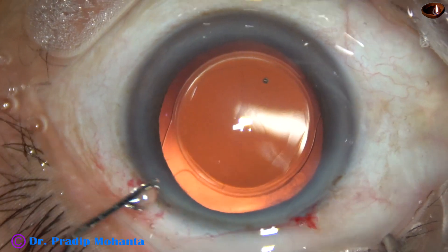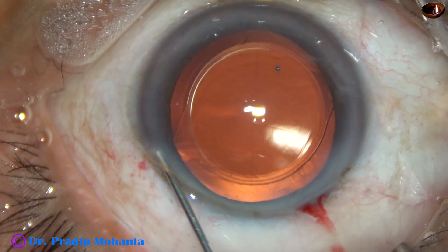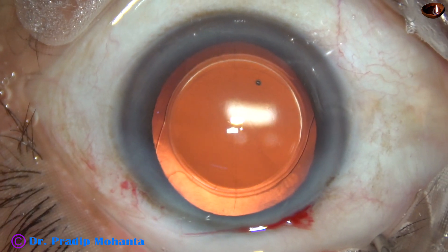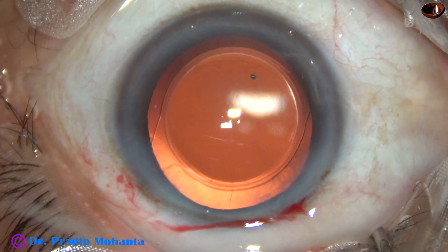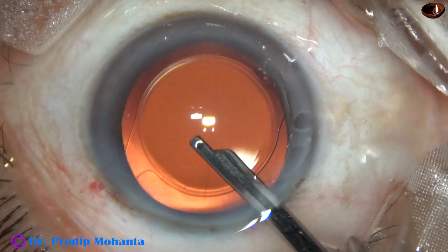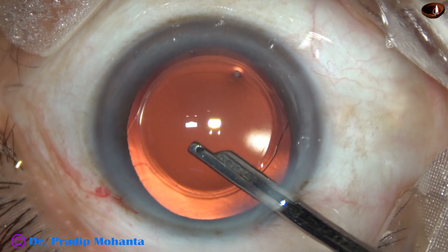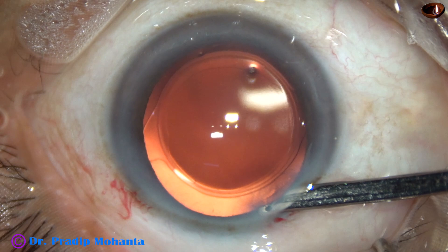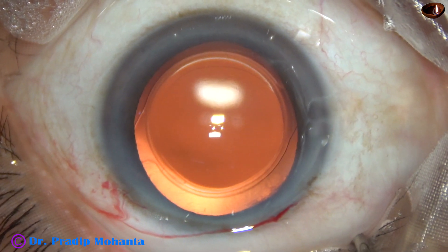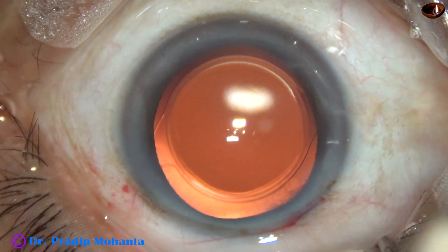And now this is a little bit of moxifloxacin. The side port is closed by corneal stromal hydration. And then this is the final lavage of the anterior chamber. Whatever viscoelastic sticks to the corneal endothelium is removed at this time. The anterior chamber is nicely formed. The wounds are checked. Few drops of moxifloxacin is applied over the cornea, and the case is concluded.